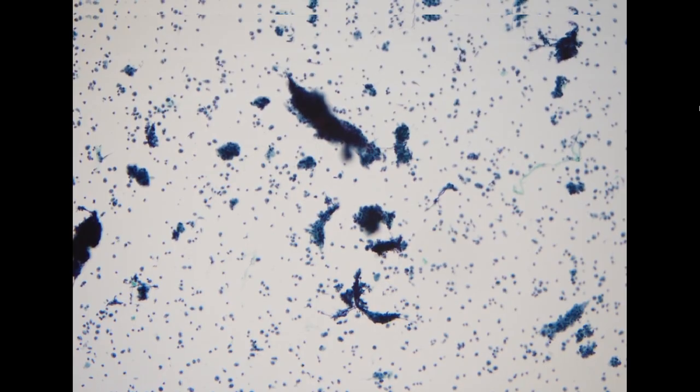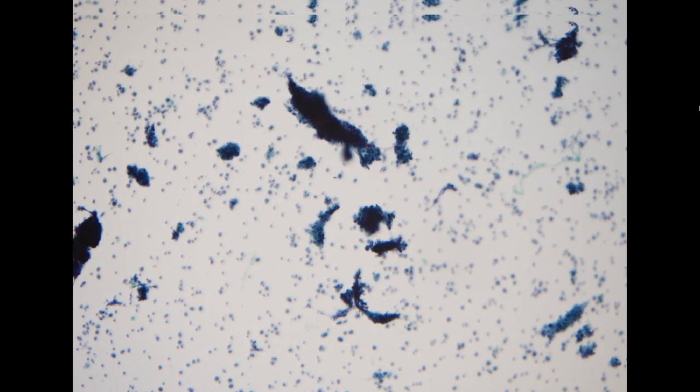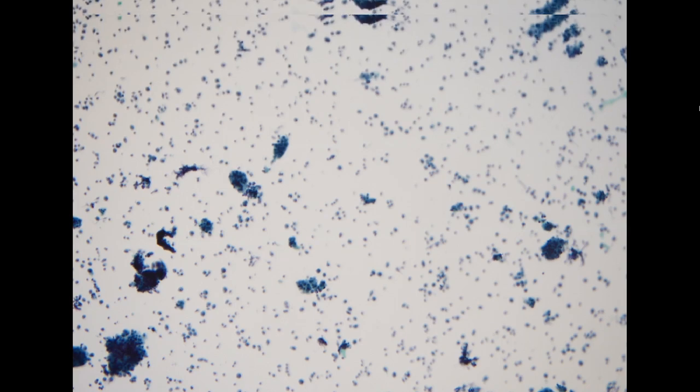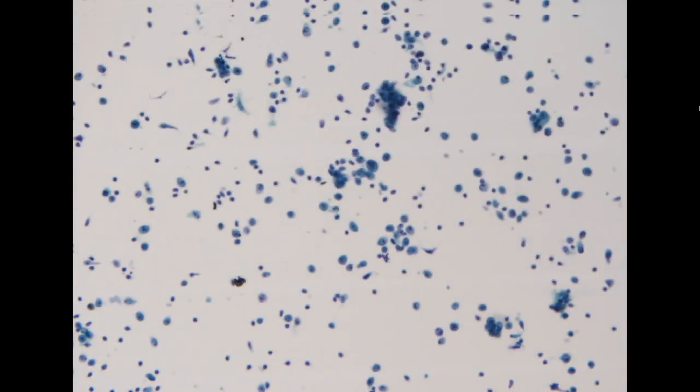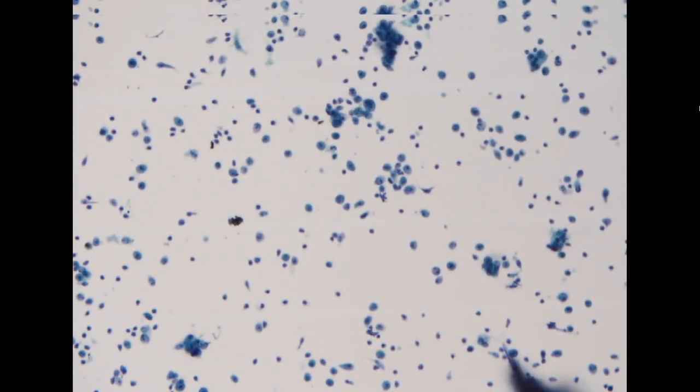So it went on and off, on and off. And finally, after 6 months, the clinician decided to do the aspiration. So this is her aspiration cytology. Sometimes this type of specimen usually is a very big challenge.